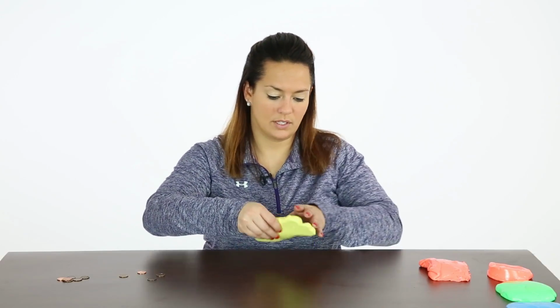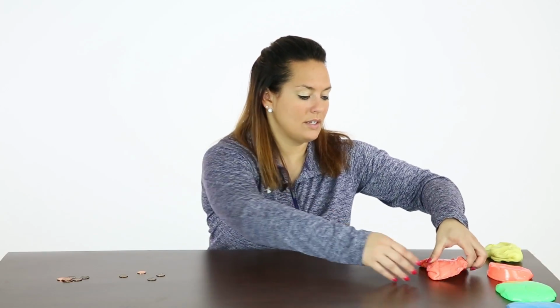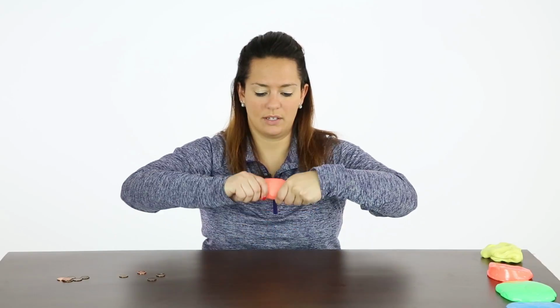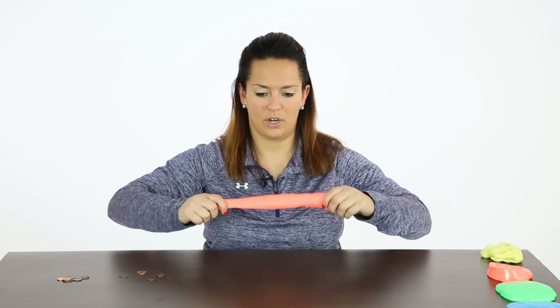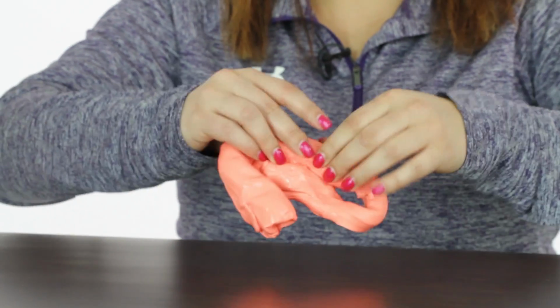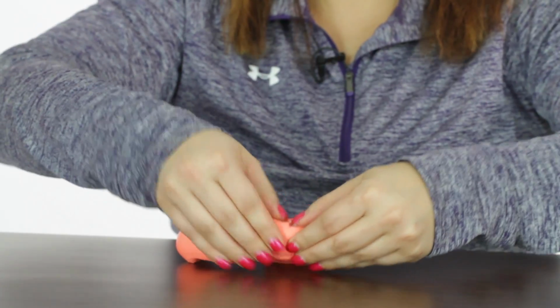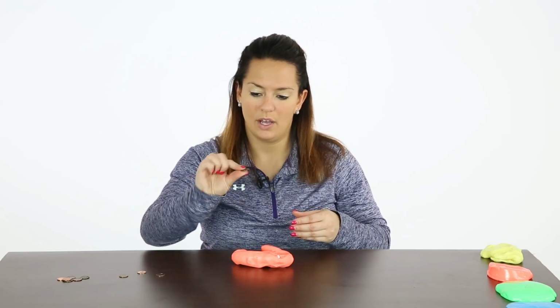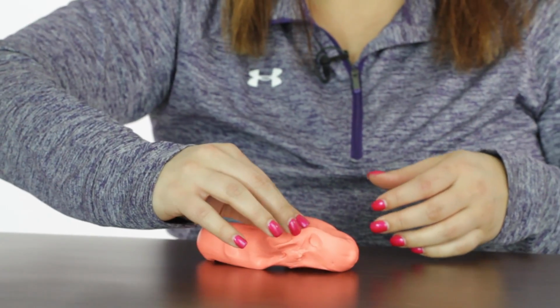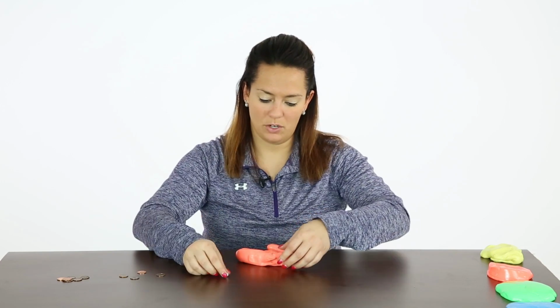And let's see, we're going to go next to the red Theraputty. This is soft, so it has a little more resistance than the yellow did, working on a little bit more strength. In this putty, I've hidden some small beads. So this is more of a refined fine motor. The pennies are a little bit larger in diameter, easier to find. These beads are a little bit smaller, so they require a little bit more digging and more of a two-finger pinch to get out.